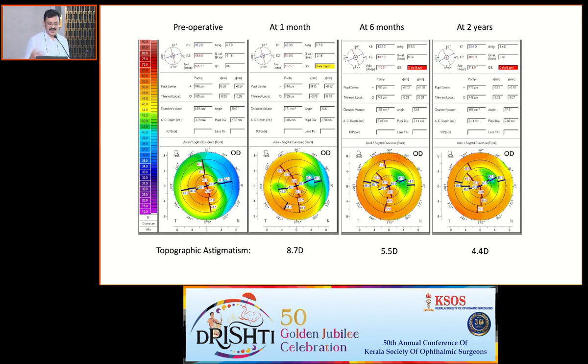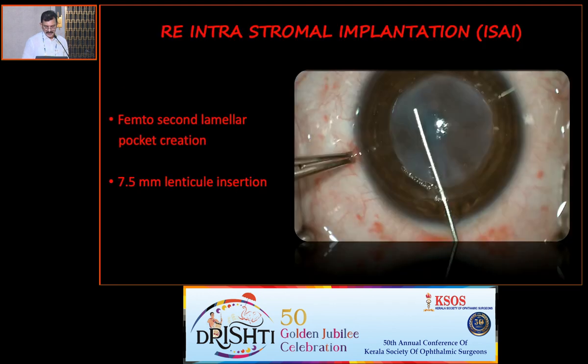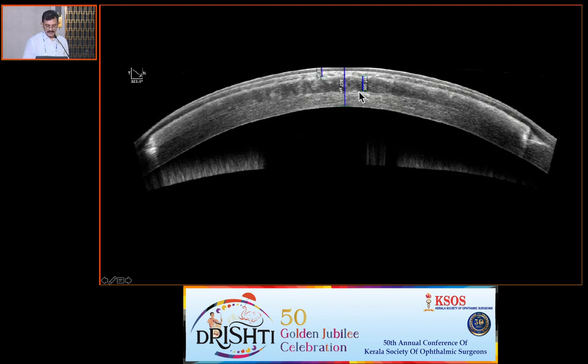So DALK we can easily give around 6/9, 6/12. So we shifted to DALK and abandoned this technique. For example, this is an 18-year-old boy with 6/18 in the left eye. So we thought, okay, one eye is good, we'll go for an insertion. This is the post-operative result, and he has improved.